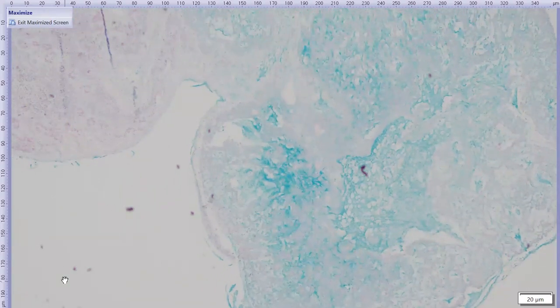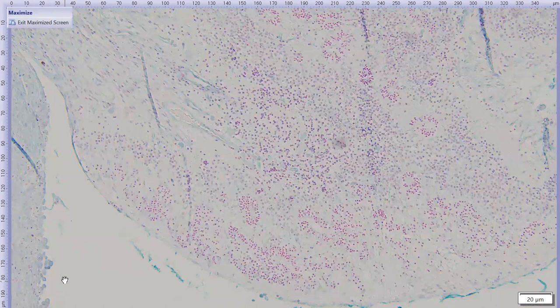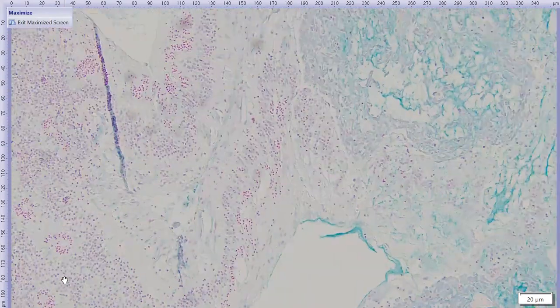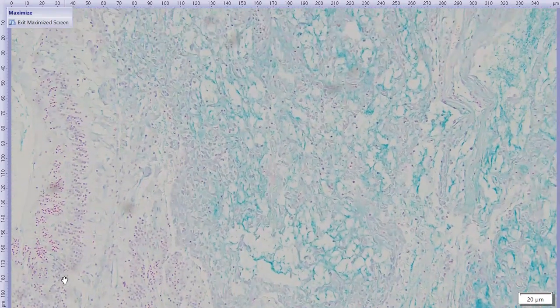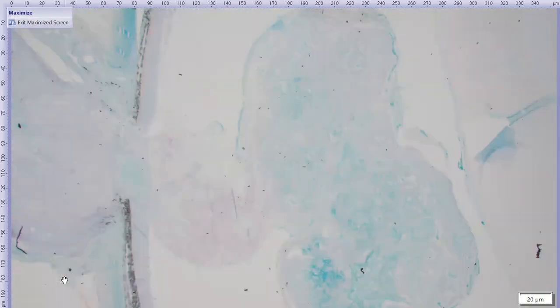And in this slightly deeper section that they did to make the Alcian blue, we can actually see a little bit more of a central section of the optic nerve head. And this tissue here is actually retina. And then as you follow the retina, it kind of blends into these neoplastic cells here. So they were invading the retina, at least. Just a really interesting and kind of weird neoplasm in this cat eye.